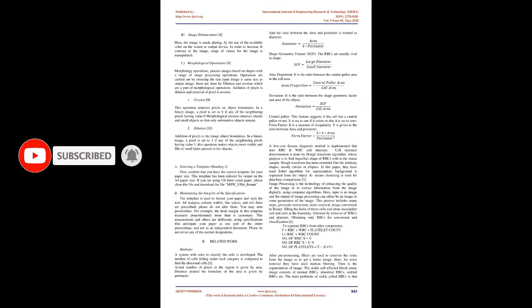Removing noise from an image is carried out by image filtering. Subdividing an image into its constituent parts is known as segmentation. Segmentation includes region growing, splitting and merging and thresholding, etc. Image enhancement methods are adapted to emphasize certain features and to remove artifacts. 5. Pre-processing. Pre-processing includes various steps like A.